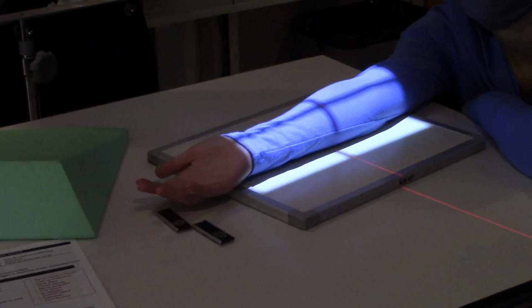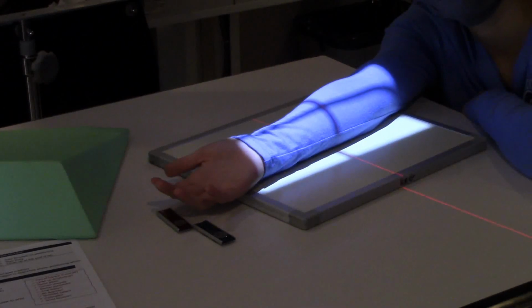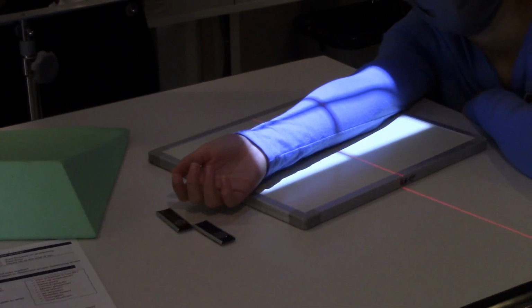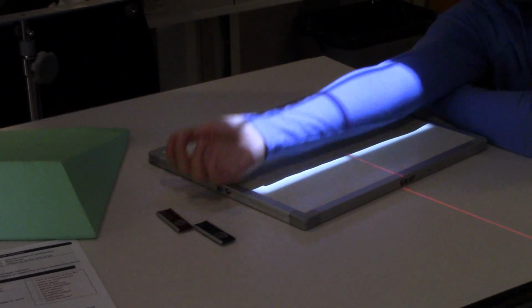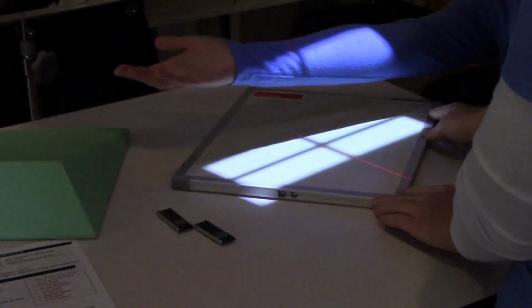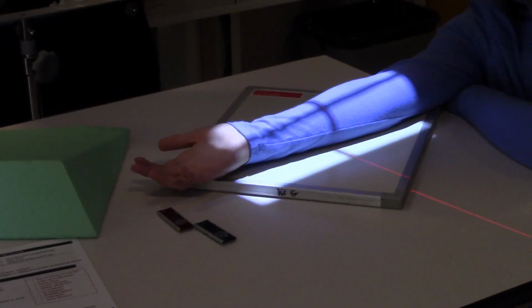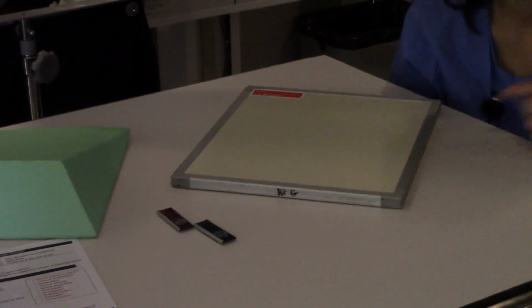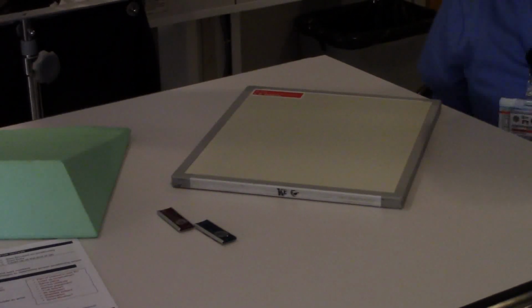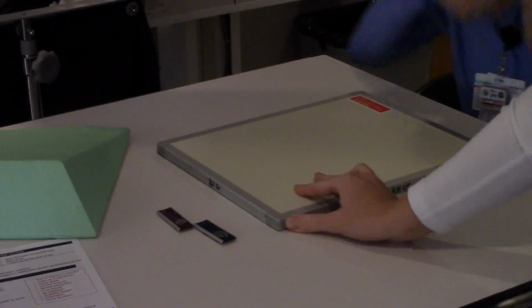Now what if I gave Ms. Abby some vitamins and all of a sudden she grew and her arm was 7 more inches long? Can you do it like that? Well, that's a possibility. You could totally shoot it diagonally. But what I was driving at was reach over and get a 14 by 17 image receptor. Just switch to a bigger image receptor.